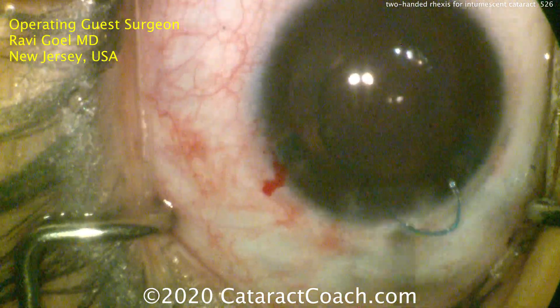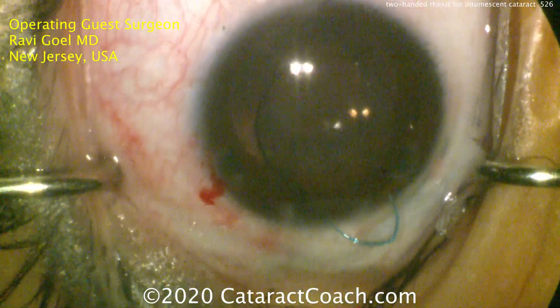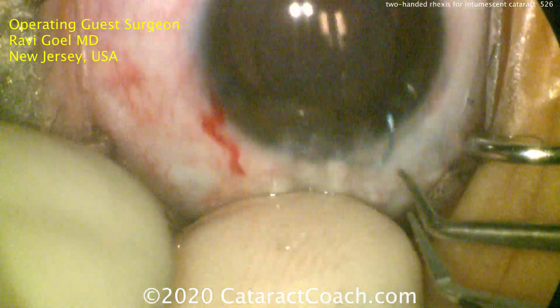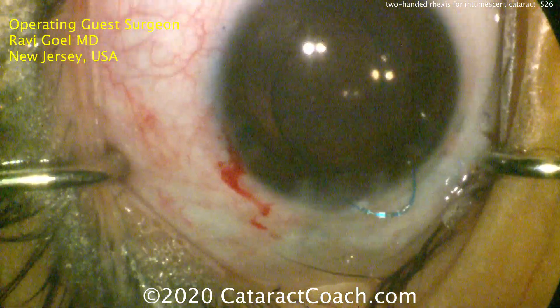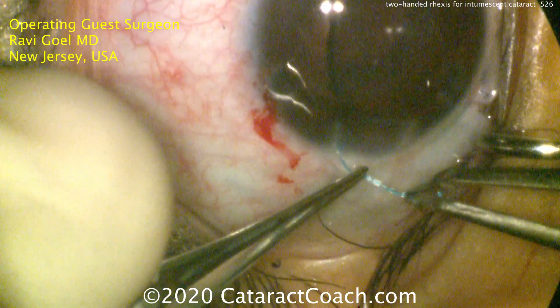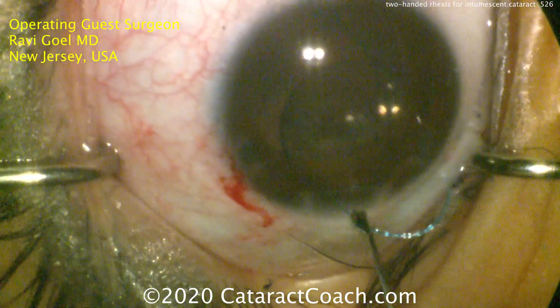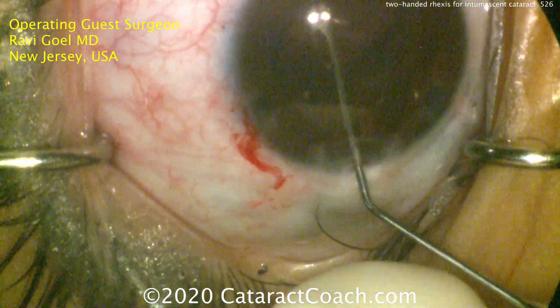If you see that damage there, don't just put it in the eye and leave it damaged. These haptics do have the ability to be straightened out again, so get back to the normal curvature. All you need are a couple of forceps — two tying forceps works great. Here, using one with his finger and grabbing it to straighten it out until it's a more appropriate form. If you put in one haptic with it bent like that, you may have mispositioning of the IOL — it may sunset or be tilted. That looks much better. Now the lens can be dialed in very appropriately and the whole thing goes in the capsular bag.